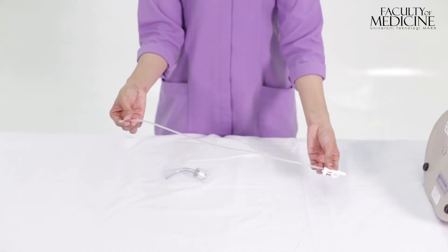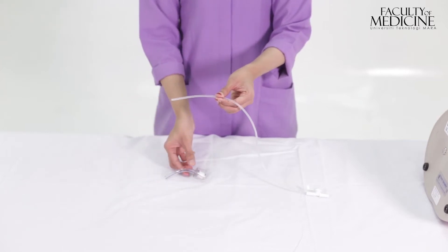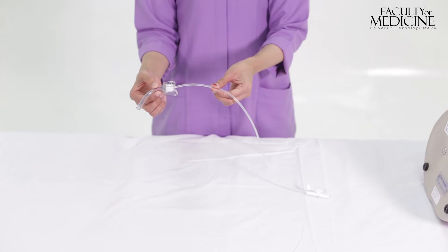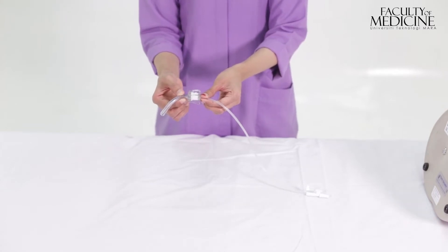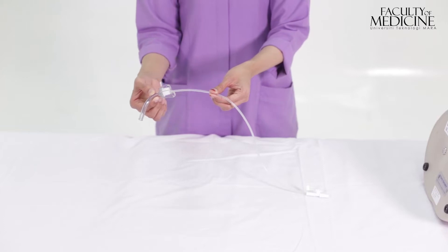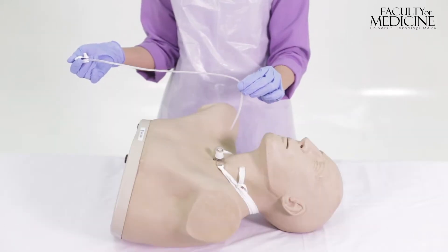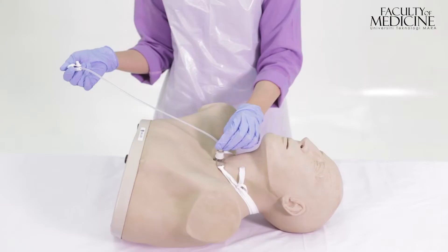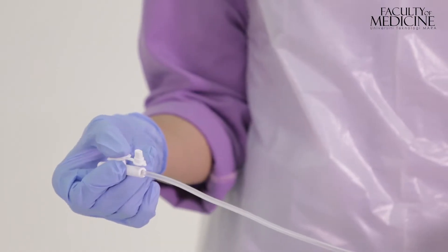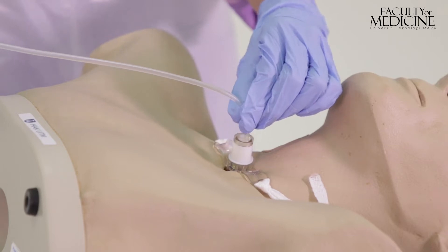The length of the suction catheter is marked to approximately 10 centimetres. This is to ensure that it does not go beyond the tip of the tracheostomy tube when inserted. The suction catheter is inserted up to the marked point and then activated. The suction catheter is then slowly withdrawn while rotating.